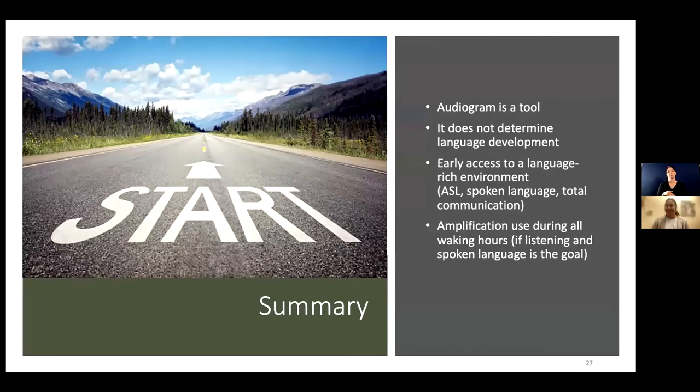All right, we made it. So in summary, an audiogram is a tool. It's a tool for describing your child's hearing level. It's a starting point to determine appropriate supports, to determine if amplification is needed, how much amplification is needed, and it can help to guide conversations around decision-making about which communication method is going to fit best for your family, whether ASL, verbal, or total communication.